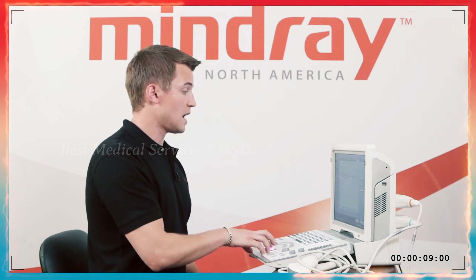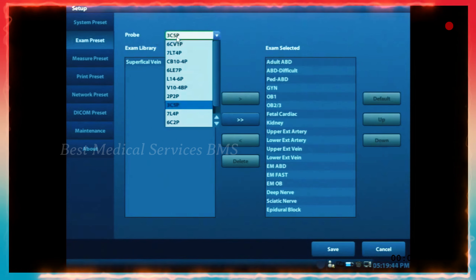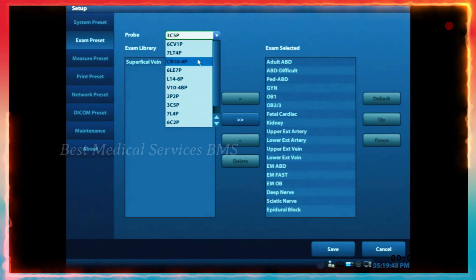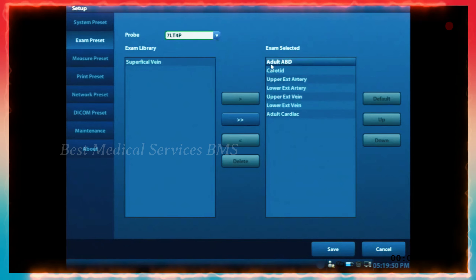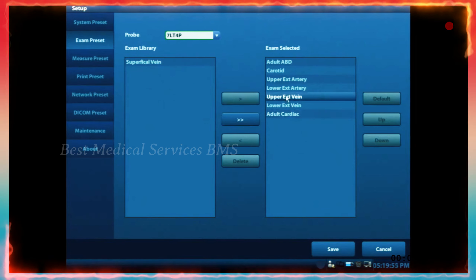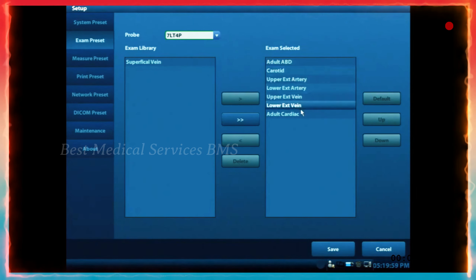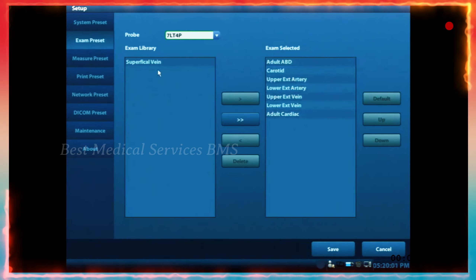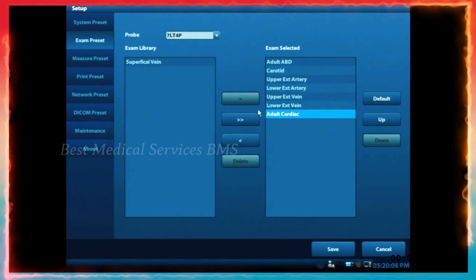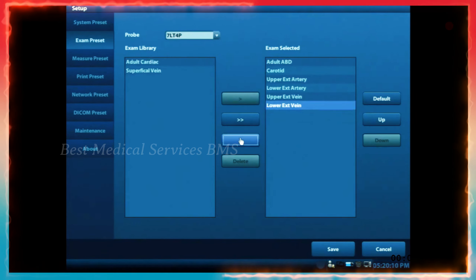Under the other tabs on the left side, you can see things like exam preset. Whatever transducers you have plugged in, you can find them in the drop-down list and see which presets are loaded onto each transducer. You can move presets back and forth — the exam selected is what's on the transducer, while the left side is the exam library. If you're using a linear, you probably won't have adult cardiac on there, so you can move that back to the exam library.